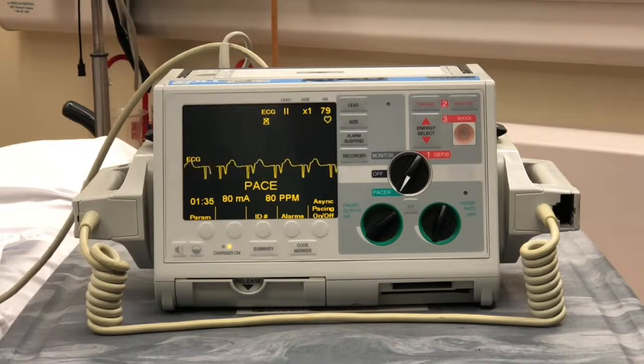patient's mental status. We understand that checking a peripheral pulse is not acceptable during transcutaneous pacing. Our patient will demonstrate fasciculations, and that can be misinterpreted as a radial pulse. So make sure you are checking a central pulse, a blood pressure, and your patient's mental status.